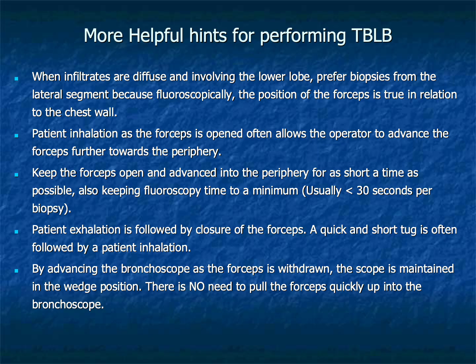Ask the patient to exhale just before closing the forceps. A quick and short tug is often followed by a new patient inhalation. By advancing the bronchoscope as the forceps is withdrawn, the scope can be maintained in the wedge position. This is crucial so that the scope is in position in case of a massive bleed. There is no need to pull the forceps quickly up into the bronchoscope after taking a biopsy.